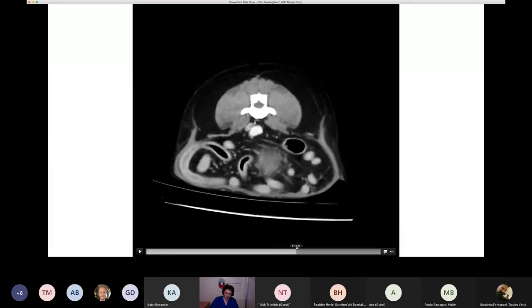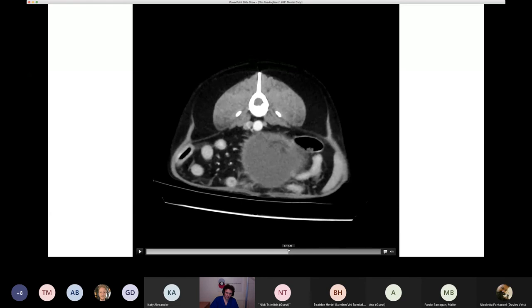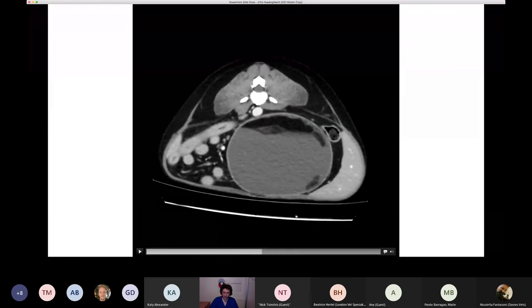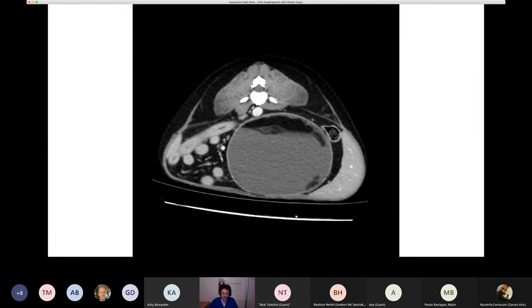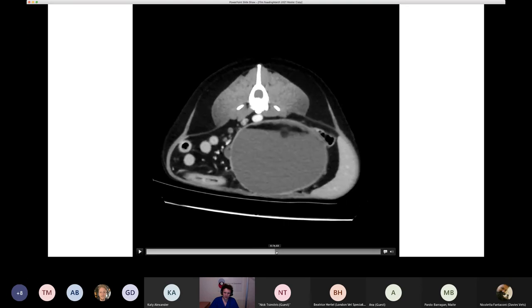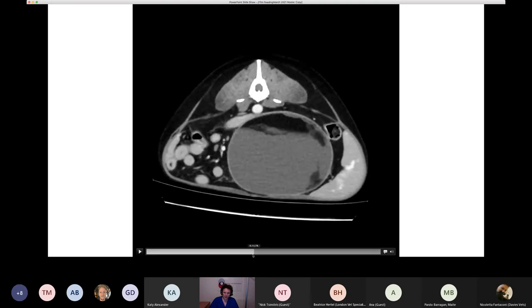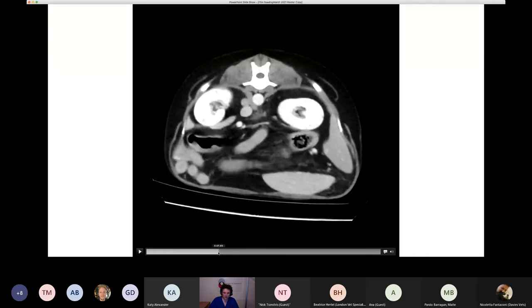And having examined this mass further after reviewing the CT, the sort of differentials that we should be thinking about now are, well, masses that you tend to see in the peritoneum. And so we were going down the road of, well, is this a big peritoneal cyst? Is this a big peritoneal abscess? Could there be a foreign body in there somewhere that we can't see? Could this be something weird, like a chicken bone, or maybe somebody left a swab in here or left something in here and we've got a big abscess surrounding it? So not really what we expected.